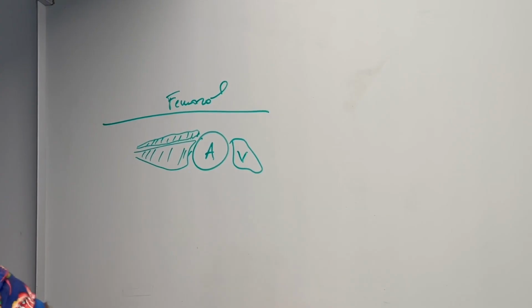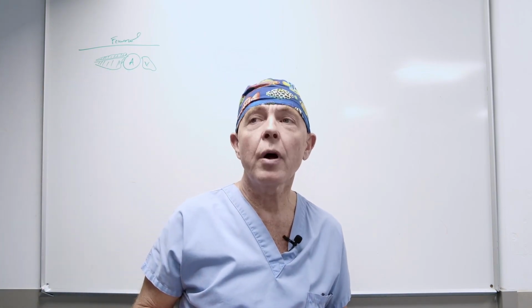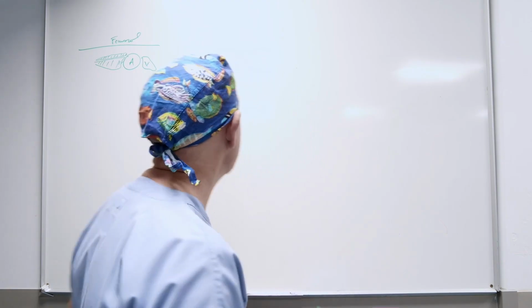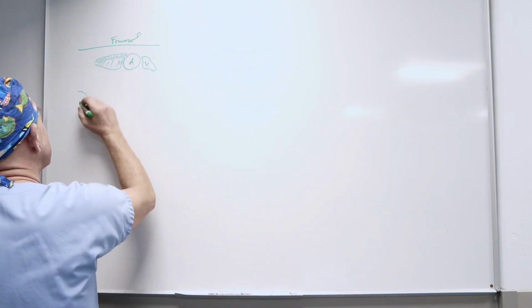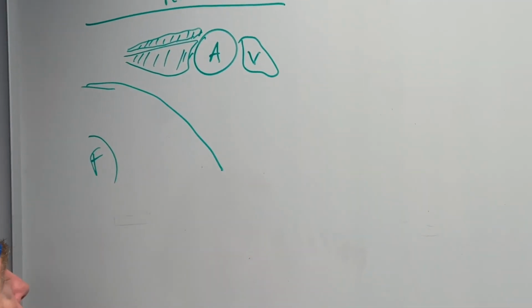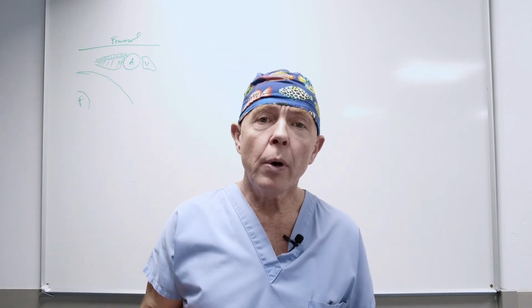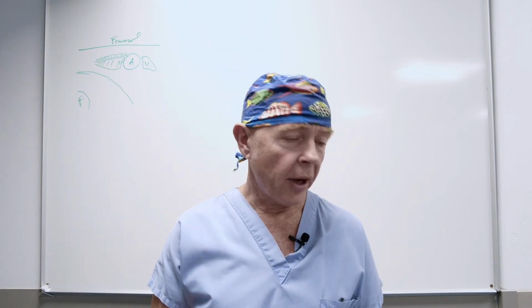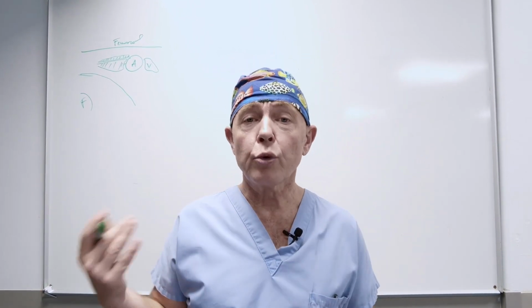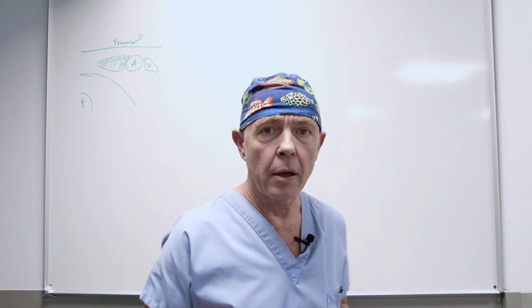Okay. These are the crucial foundational landmarks to thoroughly understand and effectively approach a femoral nerve block. Additionally, you might incorporate the femur and the iliopsoas muscles along with similar components. The second most significant block in the lower extremity is the sciatic nerve block. Consequently, I will demonstrate to you the sonoanatomy components situated at the subgluteal region.